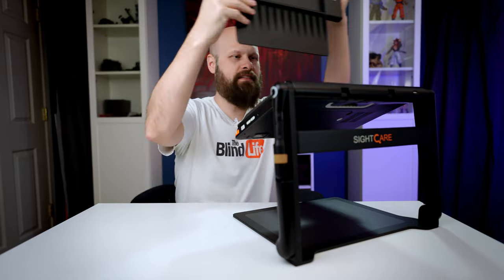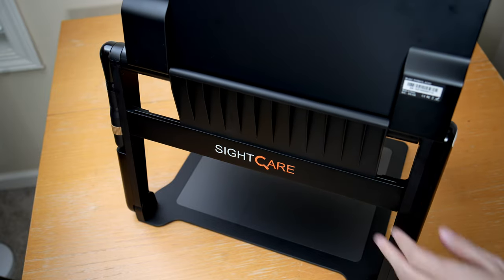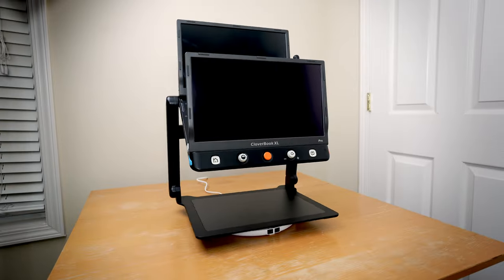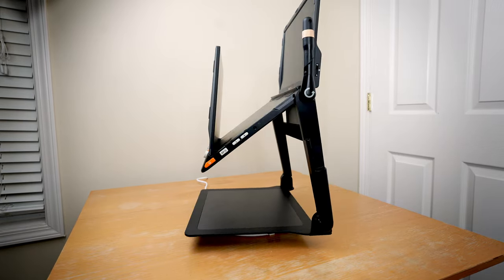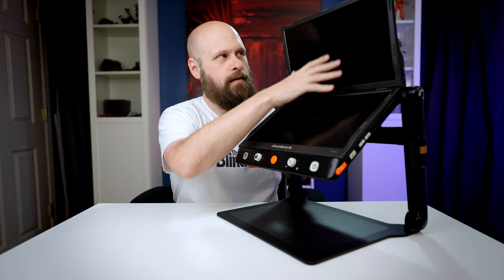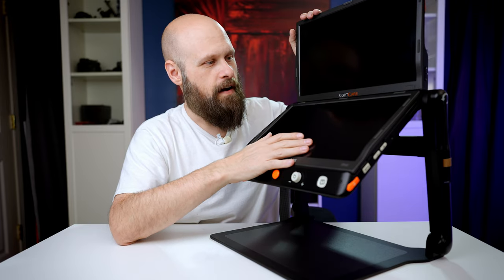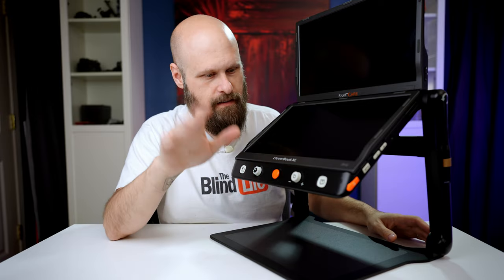The extra screen slides right in and nests into the back, giving us a dual screen setup. You can have more screen real estate, put one camera on the bottom and one camera on the top. We can even do a really cool extended screen view where the two screens act like one giant screen. We'll take a look at that as well.